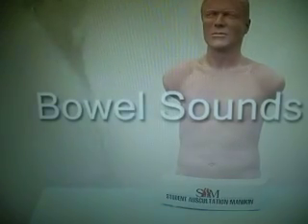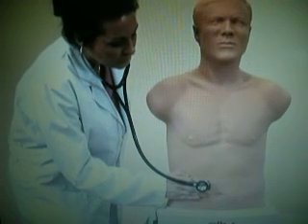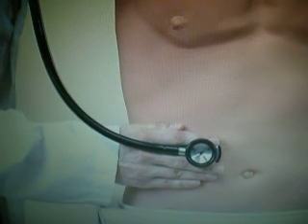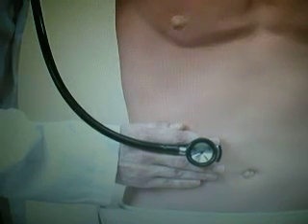SAM presents over 20 bowel sounds. They may be heard in the upper right and upper left abdominal quadrants. Listen to the sound of diarrhea. Unlike heart or breath sounds, not much is seen on the monitor.